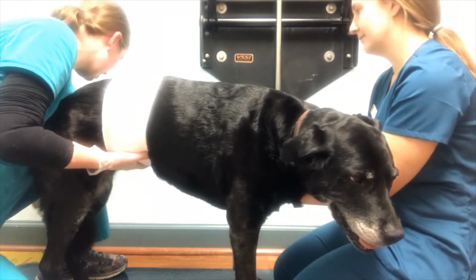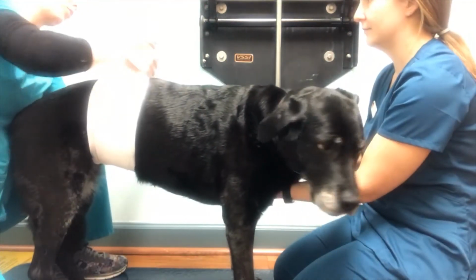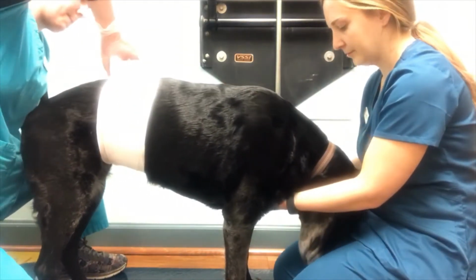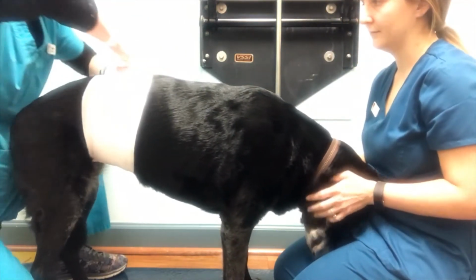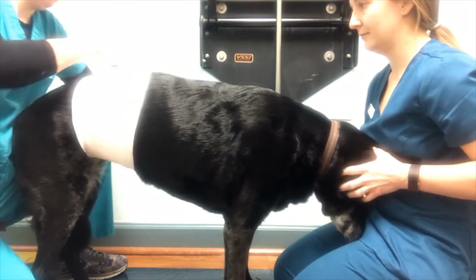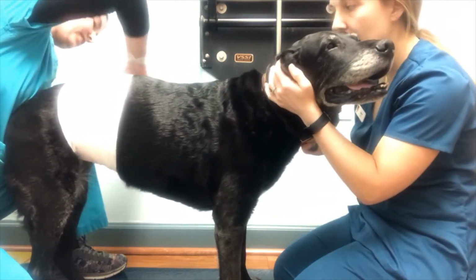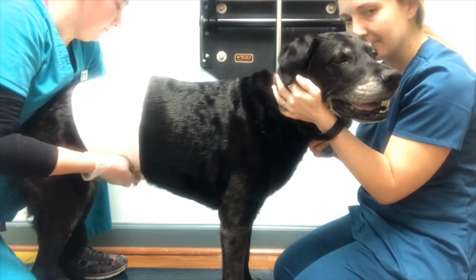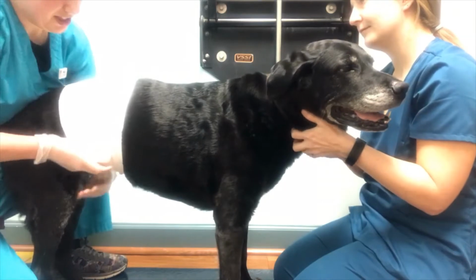Oops, okay, well, we're just going to put that one there since I decided to rip a little bit ahead of time. So I'm going to take my next roll of cotton pad, and where my first roll ended, I'm going to begin my new cotton pad. There again, I'm going to come back a little bit further for my pressure bandage. 50% overlap. And I'll go ahead and do a second layer of the cast padding. There again, 50% overlap and pulling it snug.